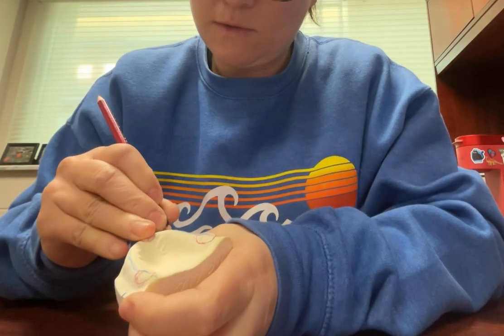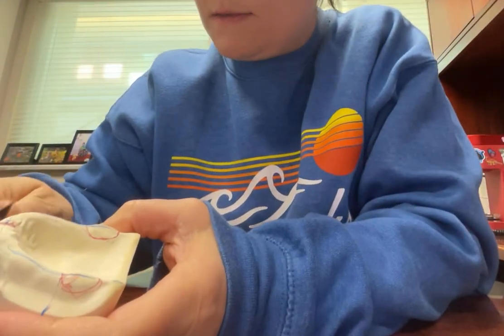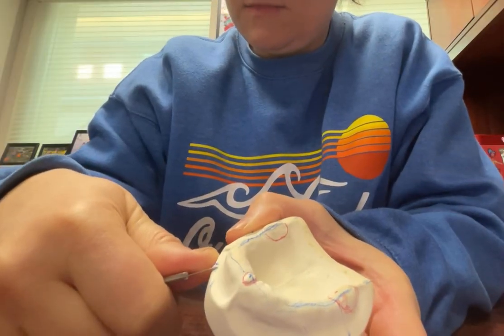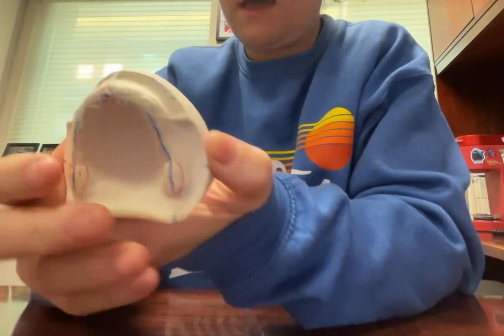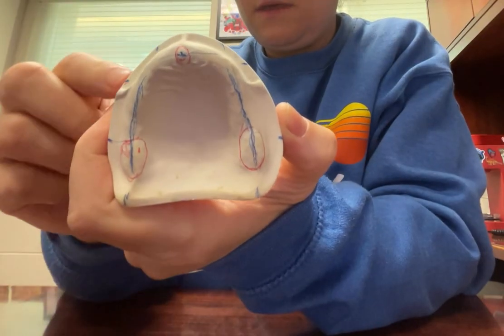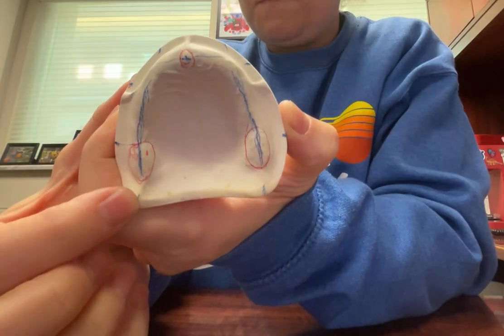This one I have marked wrong the first time. So I'm going to erase. I have my line mismarked, so I'm just abrading that. So now I have my lines where they should be for incisive papilla on either side, the crest of the ridge, and the tuberosities.